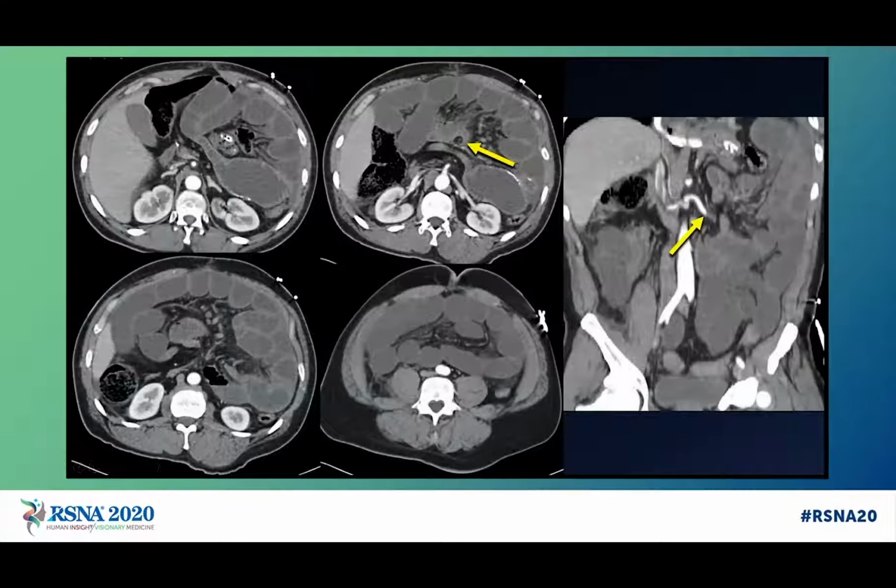Here's a patient who has closed loop physiology complicating his small bowel obstruction. This is a patient who's had a Billroth 2 procedure and who has a closed loop small bowel obstruction complicated by volvulus and ischemia. Notice the twisting in the central small bowel mesentery, the abrupt occlusion of the SMA, and the sort of dusky hypo-enhancing appearance of the majority of the small bowel. And unfortunately, most of this man's small bowel was ischemic in surgery, and this was an internal hernia through the transverse mesocolon, resulting in this mesenteric twisting and obstruction.